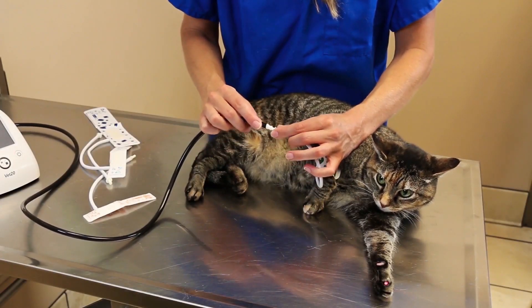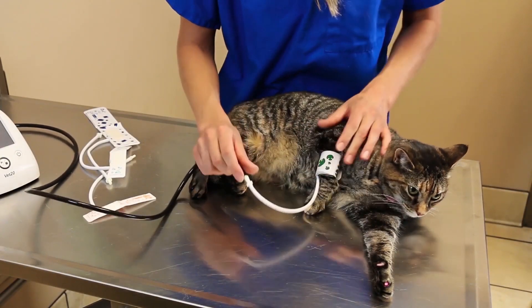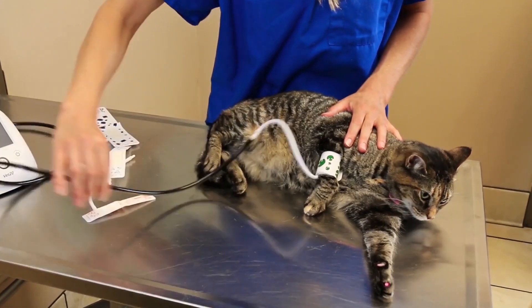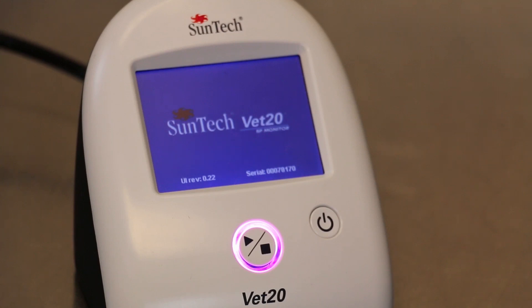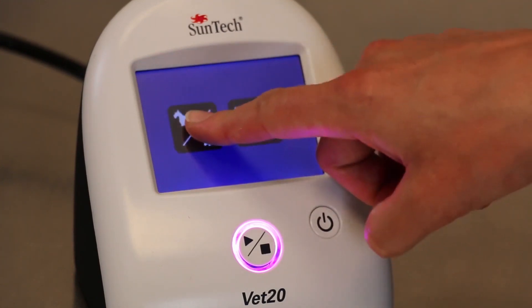With the proper cuff in place, connect the cuff to the patient hose of the SunTech VET20 BP monitor. Turn on the monitor and choose the correct mode that corresponds with the size of the patient you are measuring.